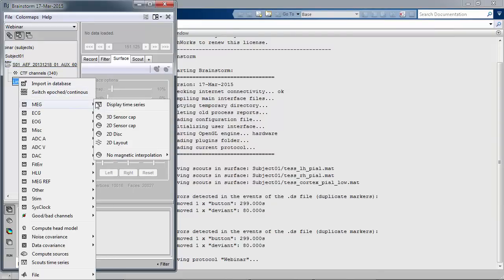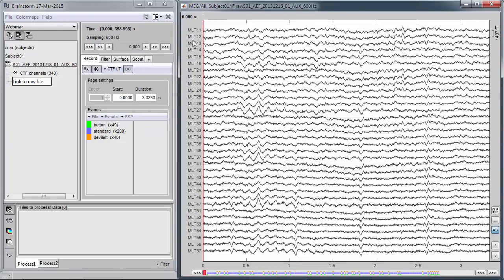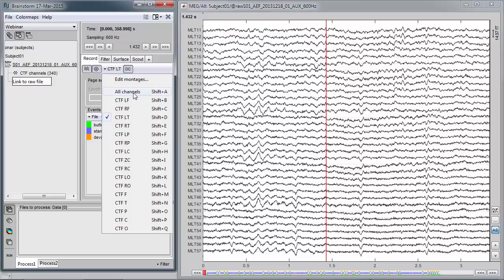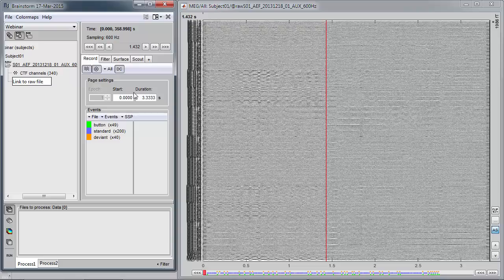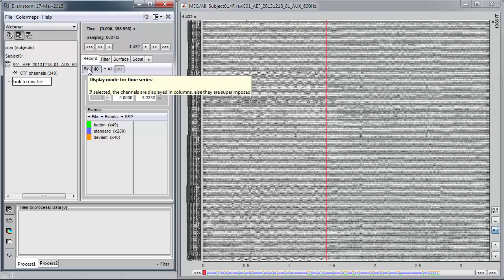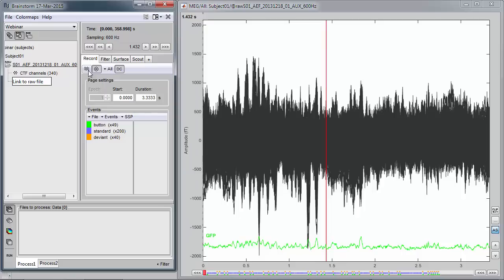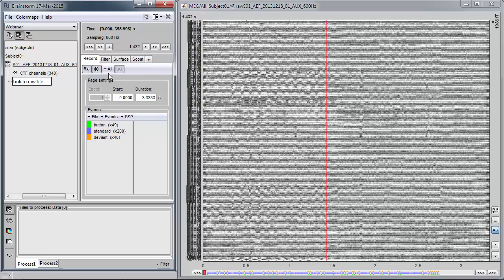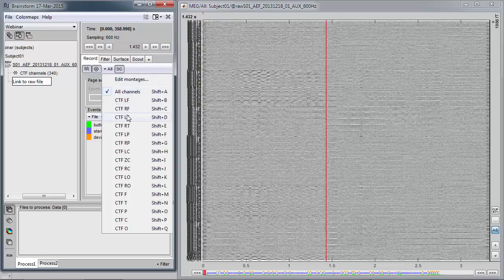Right-clicking is very useful and powerful in Brainstorm — it brings up contextual menus. We can display the time series of MEG and other channels. This is a view where basically you have a sub-selection of sensors. It's a typical page that electrophysiologists use a lot — each row is a sensor. You can look at all channels at once. We have close to 300 sensors here over minutes of recording. Here we display only about three seconds. You can use a butterfly view of the different time series, or go back to sub-selection like the left temporal sensors.